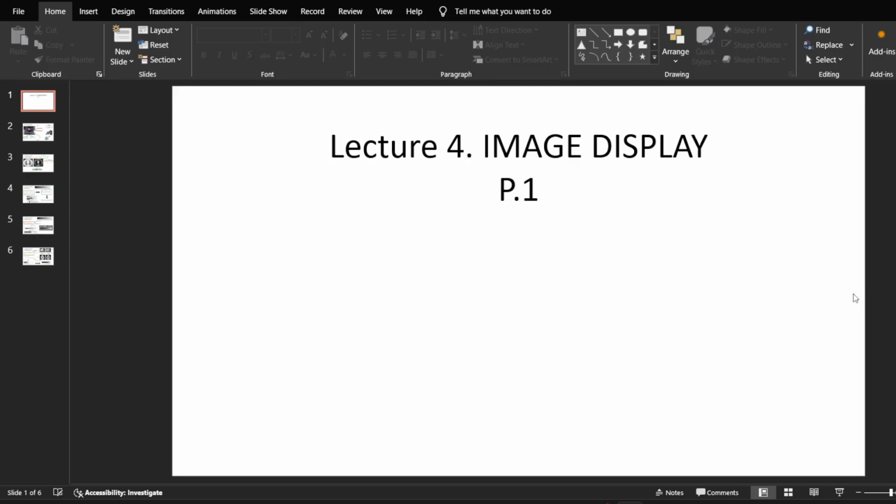But the point is, because it is used so much, so usual, people usually don't think about it, and I think you also. You change the Windows setting all the time, on the CT image and the MRI image too. You change the brightness and the contrast of the image. But not because it's so easy should we ignore it.